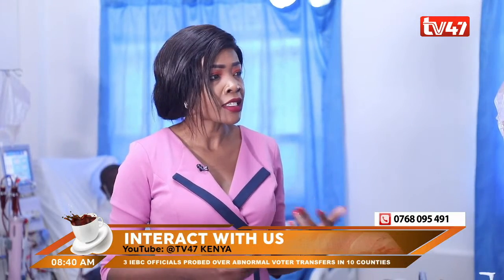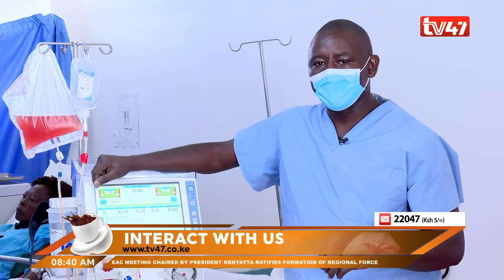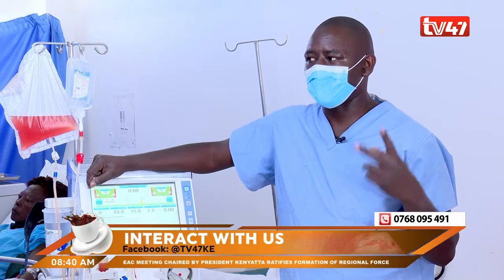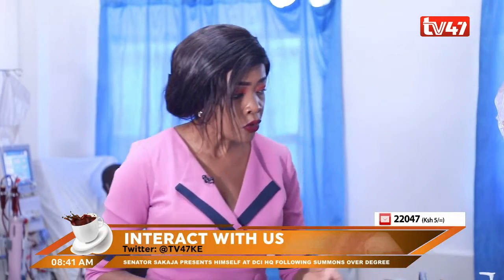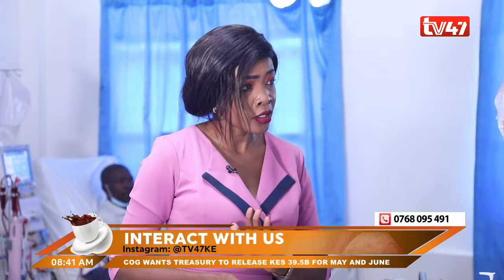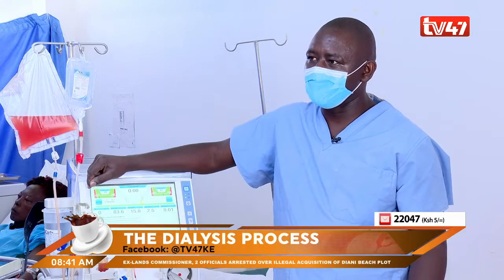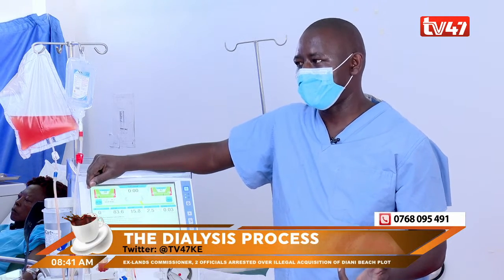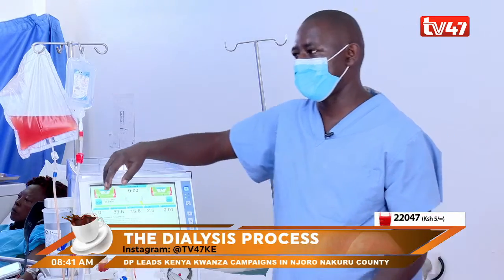How often does one then need dialysis? Most patients who are doing dialysis are using the NHIF card, and the NHIF card provides for 2 sessions per week, twice per week. So how long does the session take? For instance, I've just seen one of the patients walk out. They're done with the procedure? Yes. Is it necessary that they have 2 sessions per week, or even more? Even more. We recommend 3, but because of the financial issues, we do 2. And this keeps them going? It keeps them strong. They do their normal duties, which they used to do.